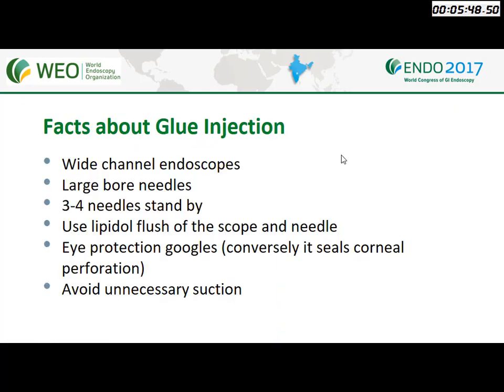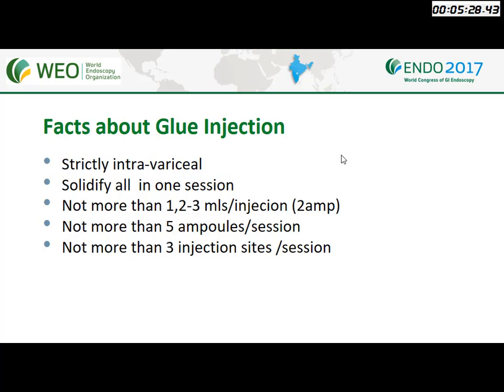Well, about glue, you have to use wide channel scopes and large bore needles. 3 to 4 needles should be on standby. Use the lipiodol to flush the scope and needle. Eye protection, and avoid unnecessary suction so you do not close the channels. Extract it. Strictly intravariceal injection. It solidifies all in one session. You should solidify the vein.